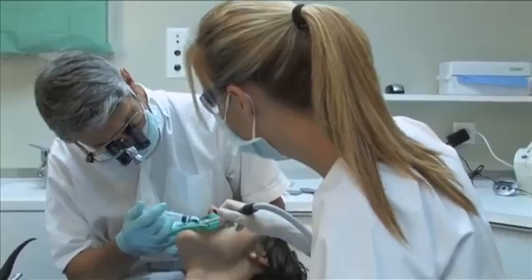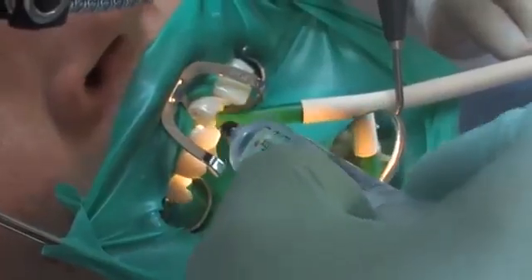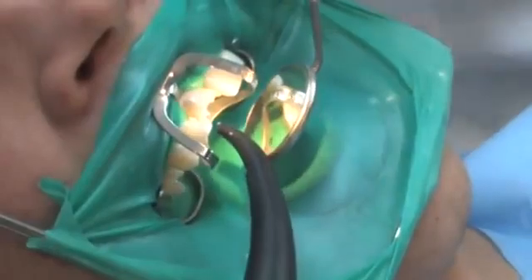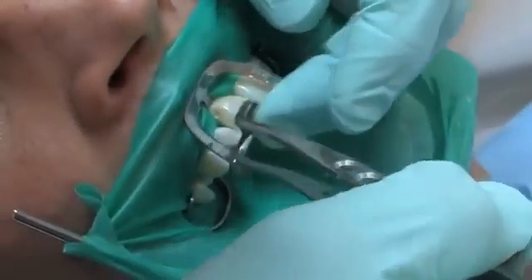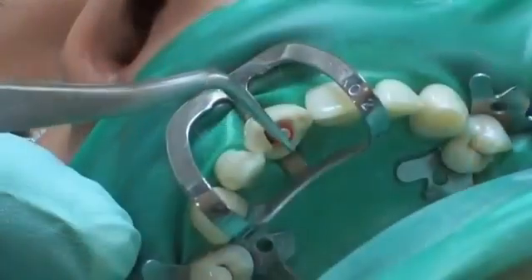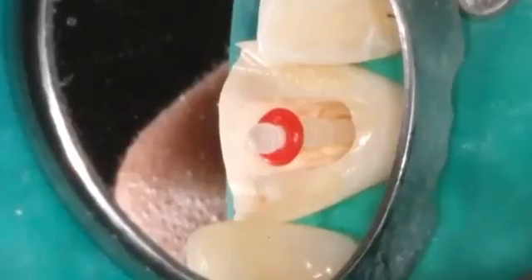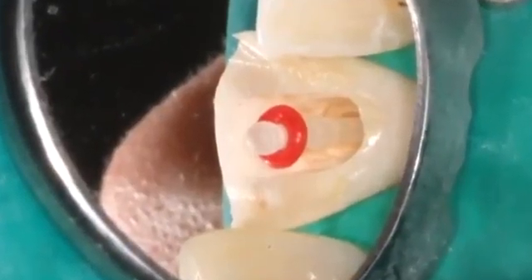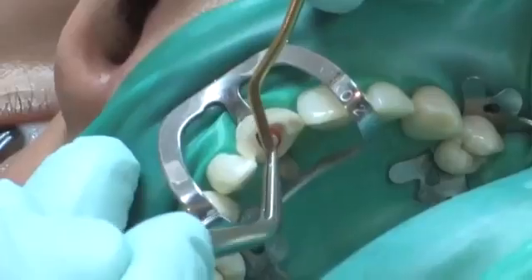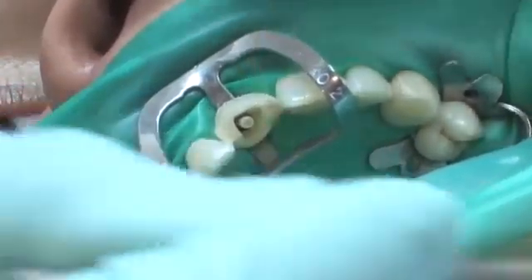The root canal is rinsed using sodium hypochlorite. The corresponding light-transmitting glass fibre reinforced parapost fibre luxe post is trial seated and inspected for proper fit inside the root canal. The post length can be shortened as needed based on the clinical situation.